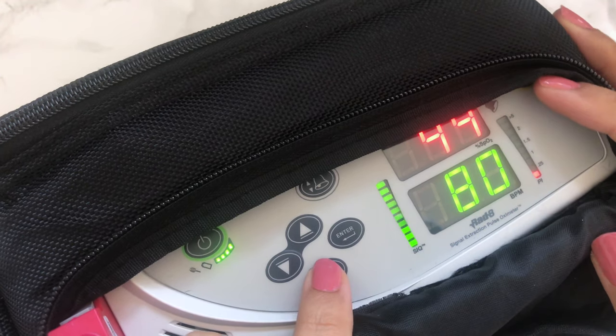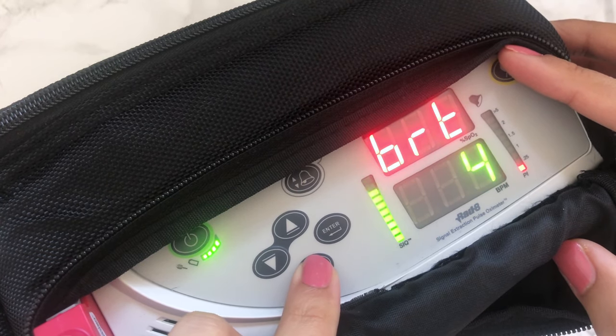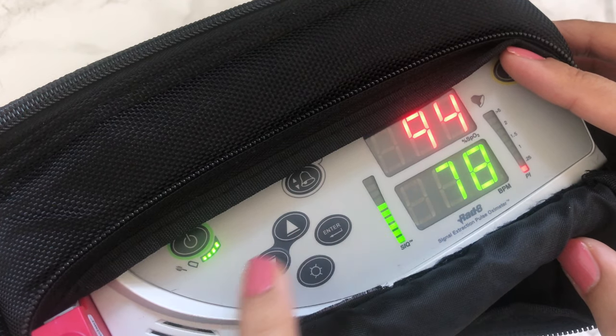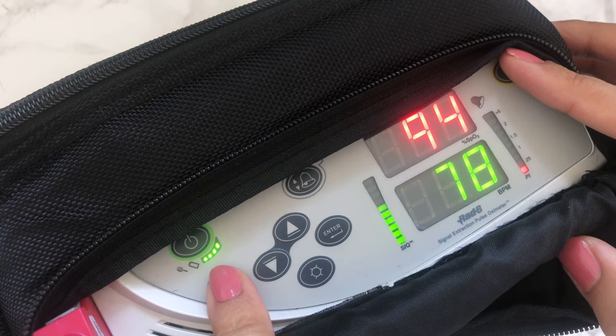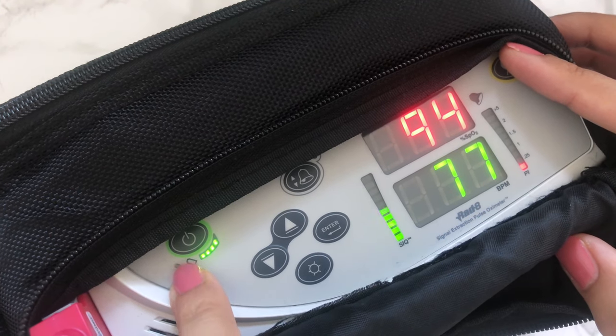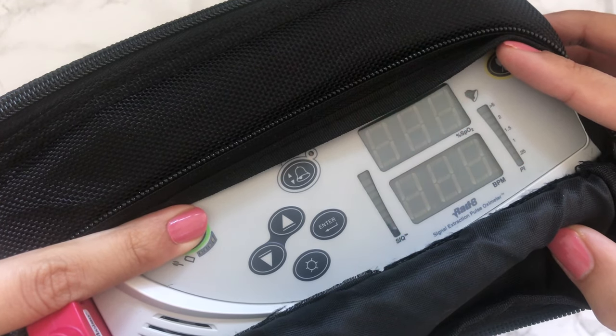Pressing the arrow key allows you to change the brightness settings — I like to keep the brightness on level 2. Once you've chosen your setting, press enter to lock it in. The bars under the power button indicate the level of charge remaining. The Masimo can run up to 8 hours after a full charge. Hold the power button pressed for 2 seconds and it switches the machine right off.